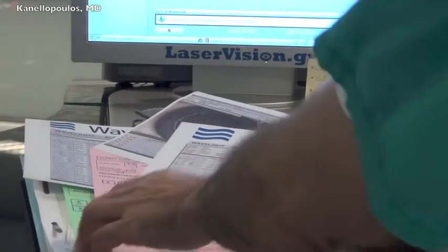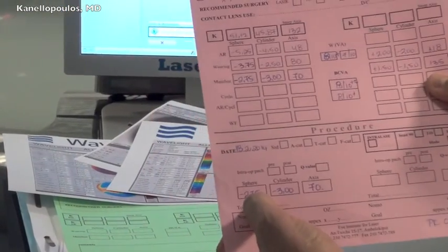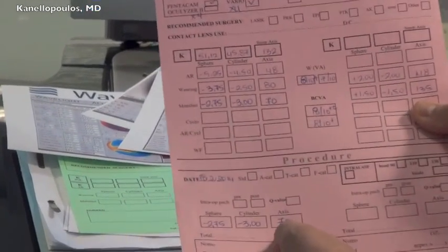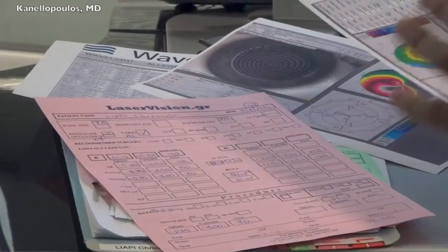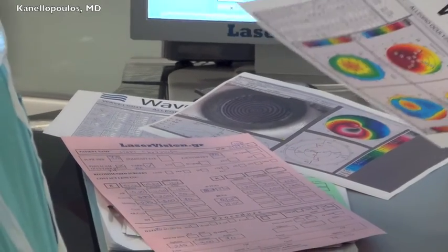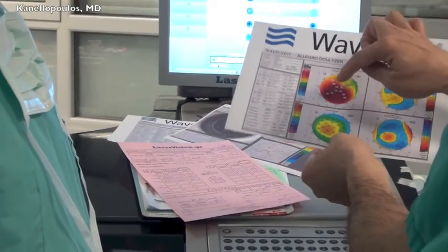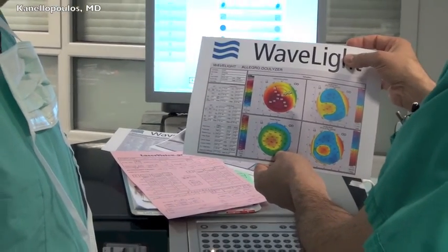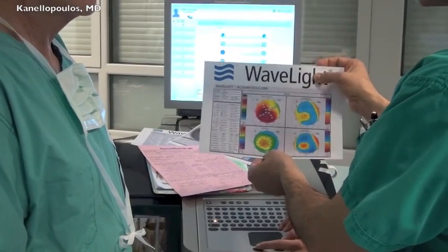Her refraction is minus 2.75, minus 3 at 70 degrees. Now, as we have advocated for many years, this refraction has to be taken under consideration with the way these patients refract, because this patient refracted monocularly probably tilts his head back a little bit, maybe squints.